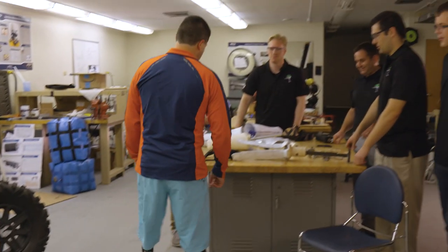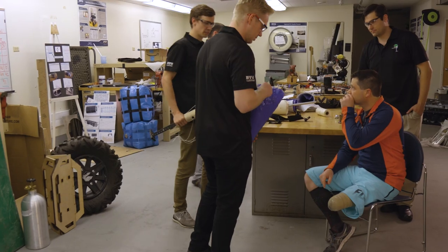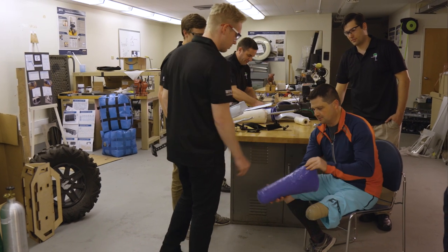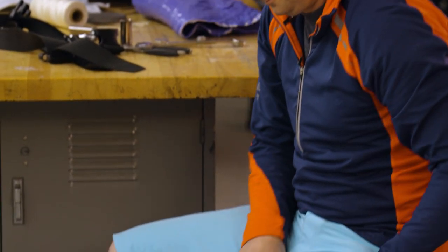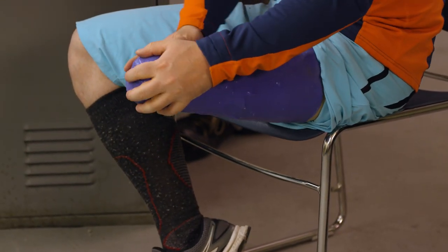In order to find out whether our socket is working or not, we had to contact a local amputee — a test subject who could try what we've come up with and say whether it works or not. Ours focuses on customization with a strut system and a vacuum mold system that molds around the limb of the amputee to provide the best comfort.